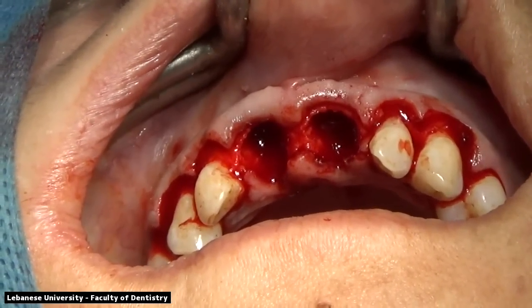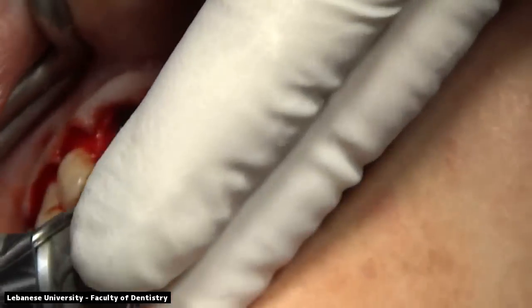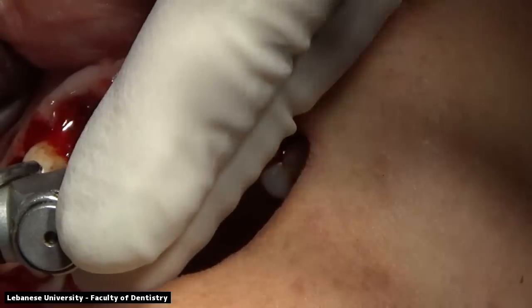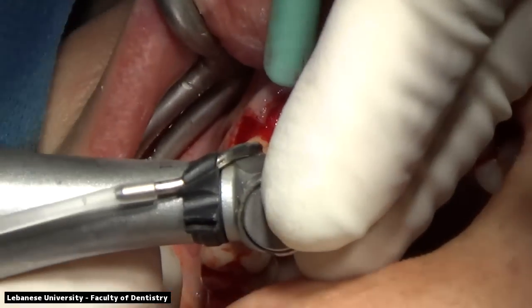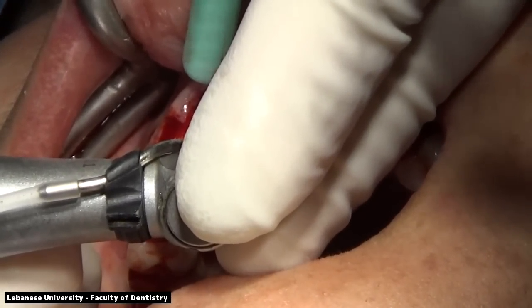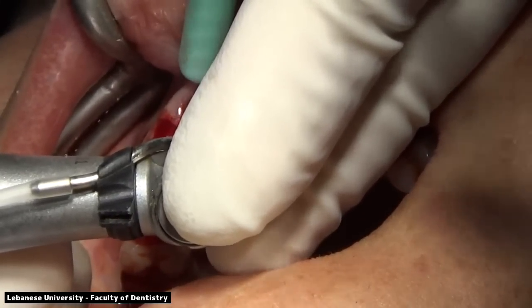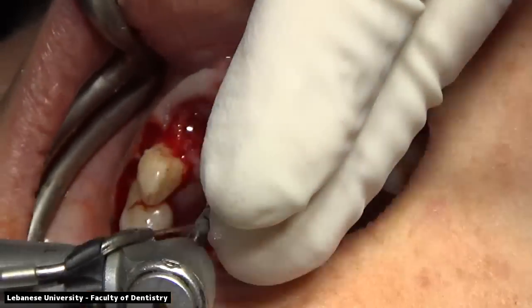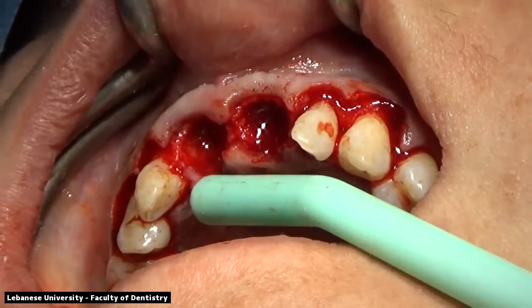But at the same time, we have to make sure that the head of the implant is going with the occlusal direction with the rest of the dentition, and that it will occlude with the opposing dentition in a proper overjet and overbite. So we're directing the head in the middle of the occlusal surfaces of the neighboring teeth, but we're going with the tip of the burr to the palatal aspect to engage the palatal plate of bone, excuse me.